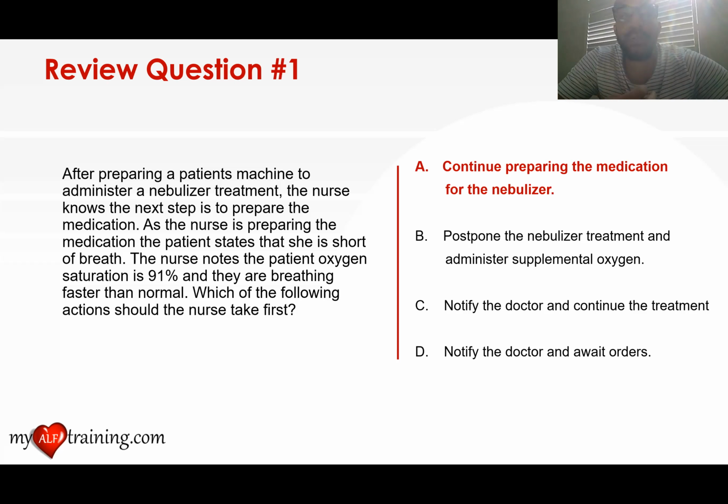And then after the breathing treatment, if the patient still feels this way, then we should notify the doctor and await further orders. But in this scenario, this nurse should first give the patient the nebulizer, because if we call the doctor, that's what they're going to say. Have you given a nebulizer treatment? Have you given a bronchodilator? Okay, well, call me after, but I'm pretty sure that that will work. That's all the patient needs.